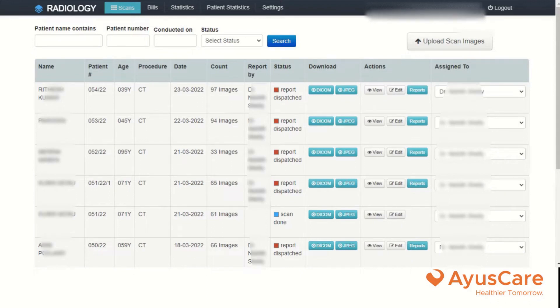In the next, to view the particular procedure, edit the procedure, and also report it.